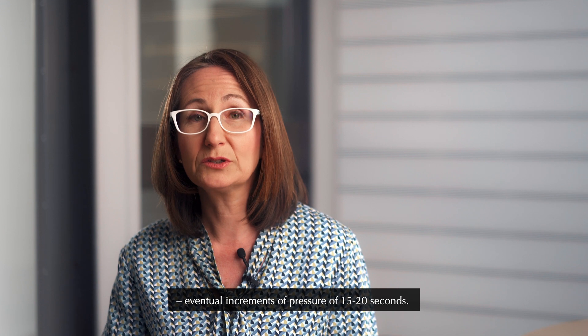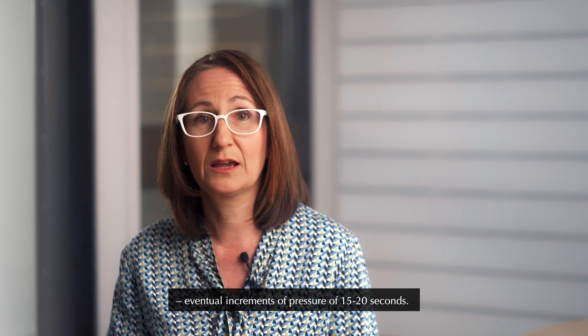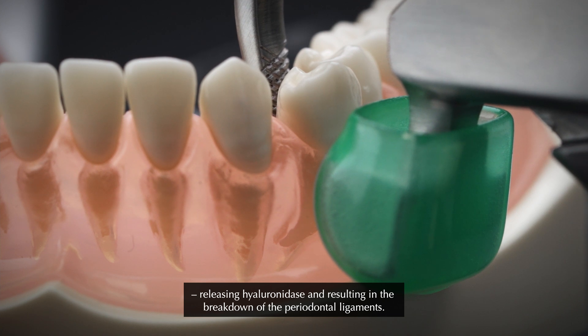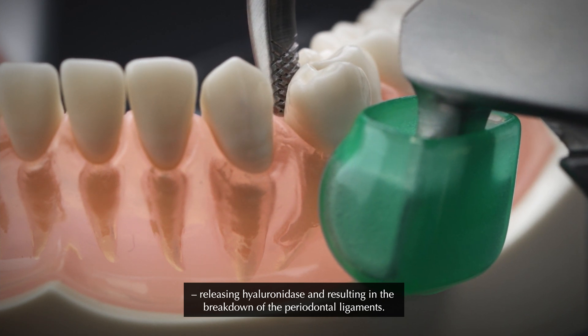This position is kept for a few seconds to one minute or longer, followed by eventual increments of pressure of 15–20 seconds. The constant and steady load on the tooth allows creep to build, releasing hyaluronidase and resulting in the breakdown of the periodontal ligaments.